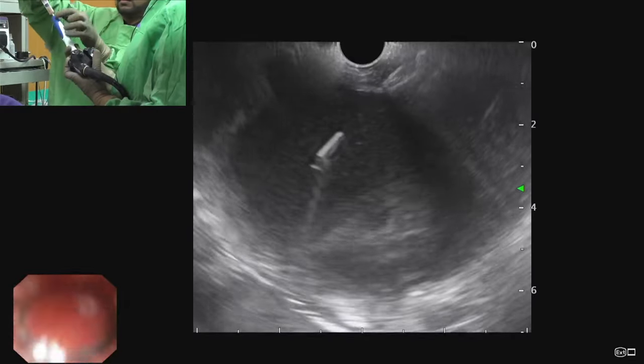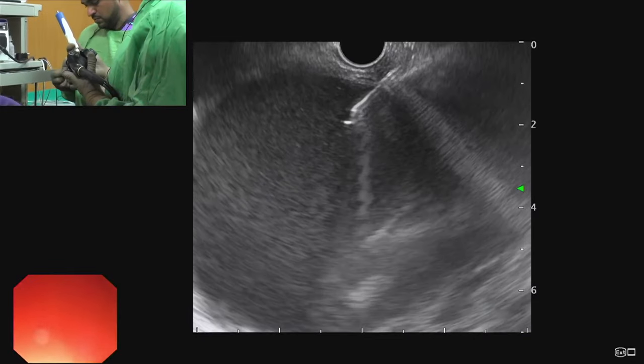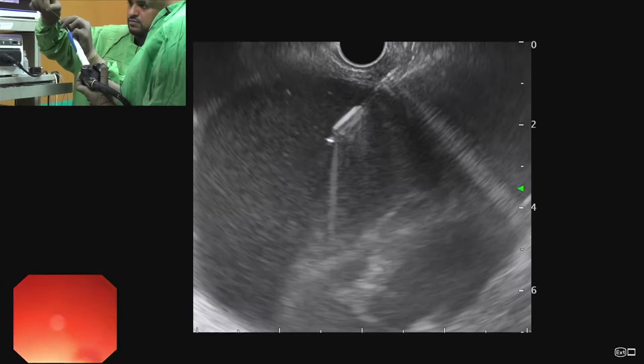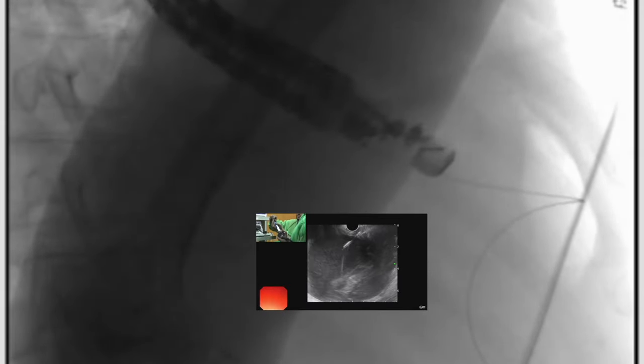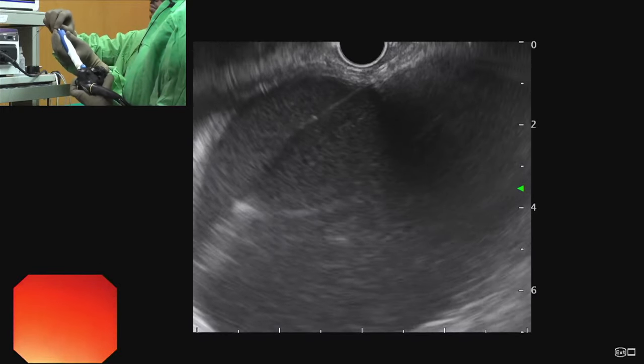After aspirating the fluid, the next step is passing a guidewire inside the collection. Once the guidewire is placed, we should make multiple loops — these loops should be confirmed under fluoroscopy. Sometimes the wire may perforate through the opposite wall of the cyst and enter the peritoneal cavity, so it is better to use a J-shaped guidewire. On fluoroscopy we can see the wire forming multiple circular loops, confirming it is inside the fluid collection.